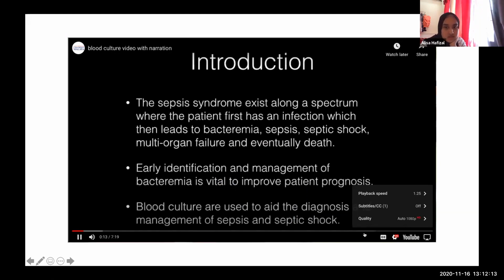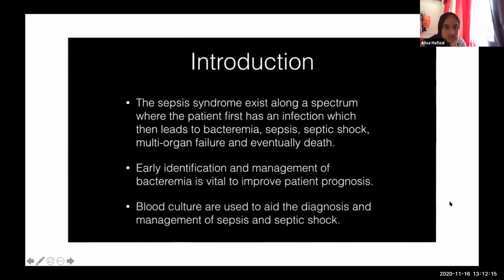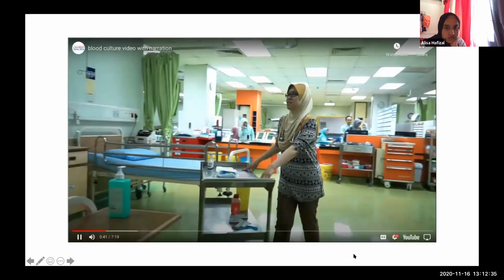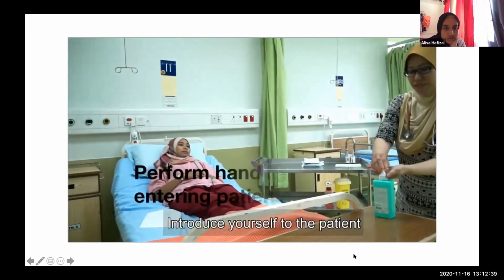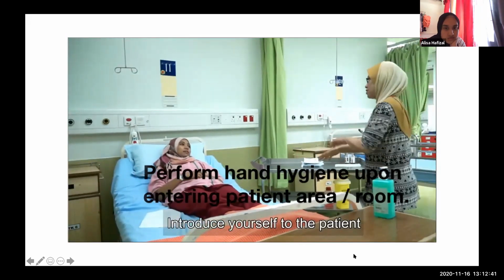Introduction. The sepsis syndrome exists along a spectrum where the patient first has an infection, which then leads to bacteremia, sepsis, septic shock, multi-organ failure, and eventually death. Early identification and management of bacteremia is vital to improve patient prognosis. Blood cultures are used to aid the diagnosis and management of sepsis and septic shock. Introduce yourself to the patient. Perform hand hygiene upon entering patient area.